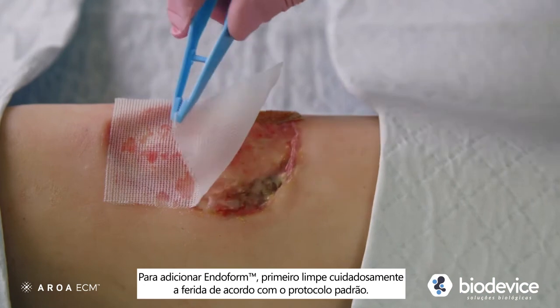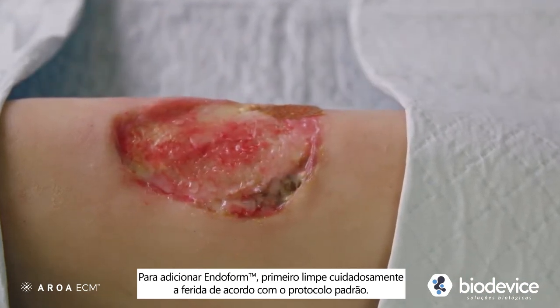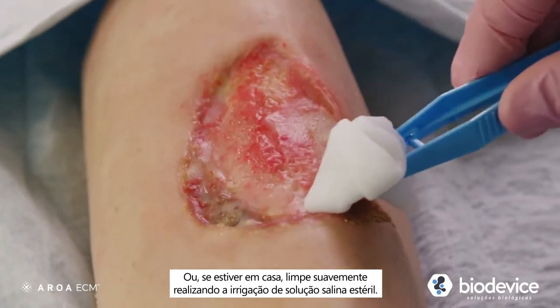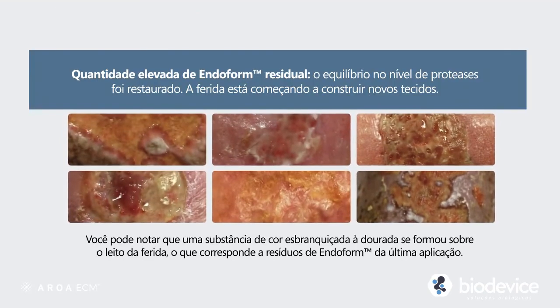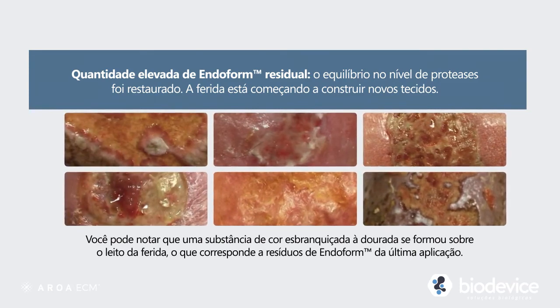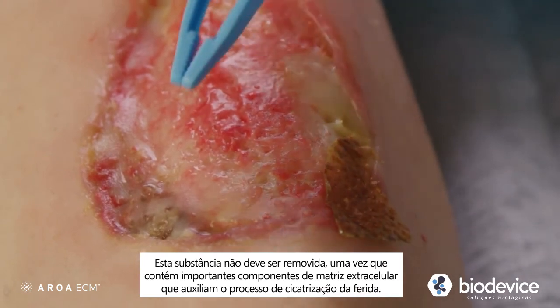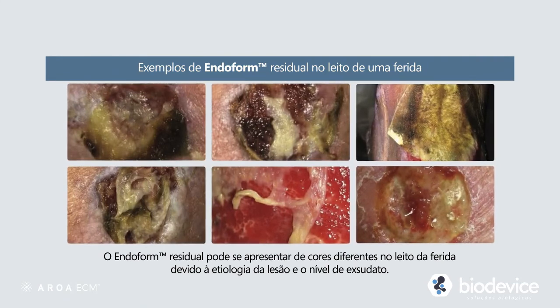To reapply Endoform, first carefully cleanse the wound according to standard procedures, or if applying in the home, cleanse with gentle irrigation using sterile saline. You may notice an off-white to golden-colored substance that forms on the wound, which indicates residual Endoform from the previous application. This substance should not be removed, as it contains extracellular matrix components which assist in the wound healing process.